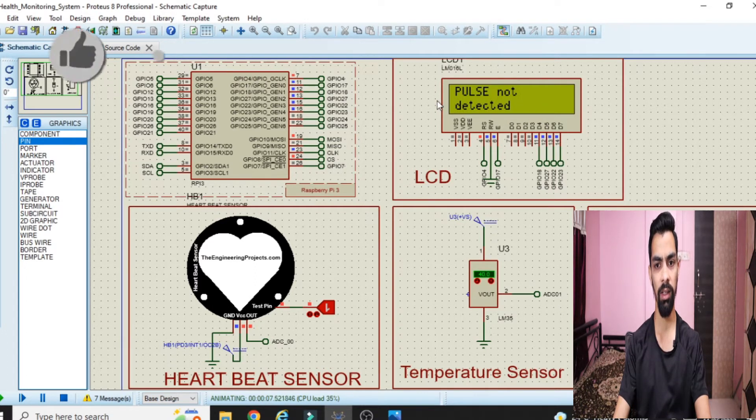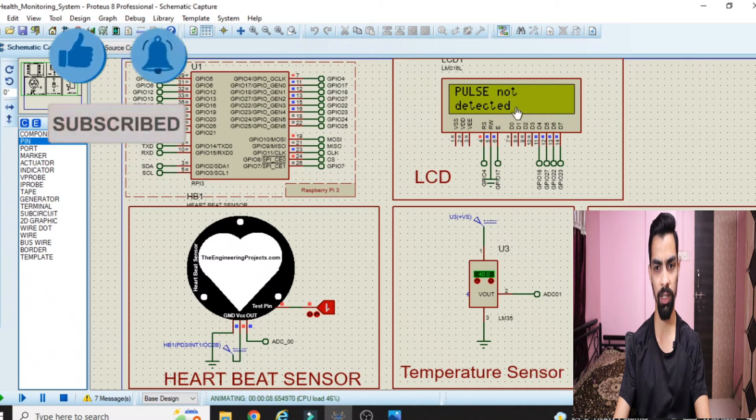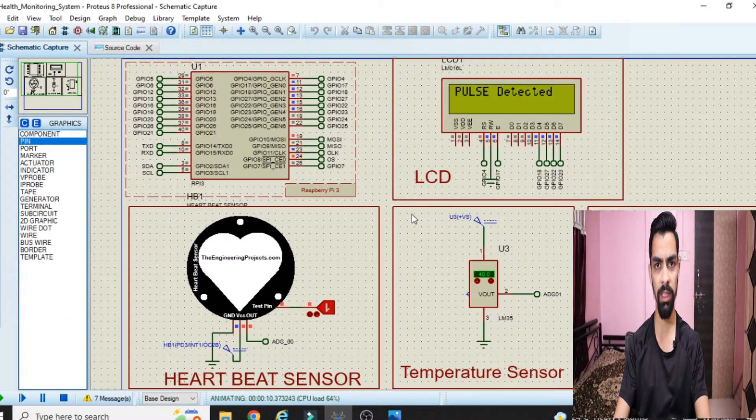Then pulse not detected, then again pulse detected, then again pulse not detected. I will explain why there are alternating pulse detected and pulse not detected readings. We have to wait about 10 seconds so that the complete heartbeat is detected, and at the end the heartbeat value and temperature value will be printed.